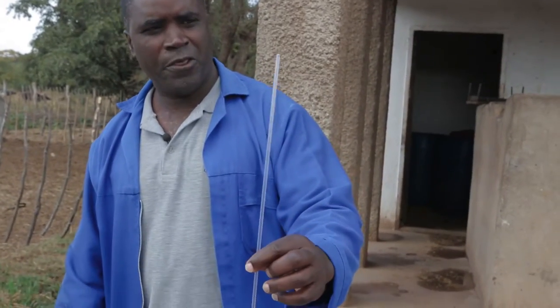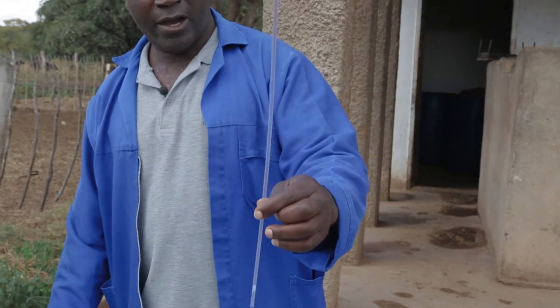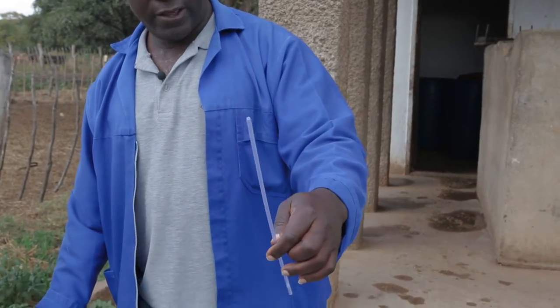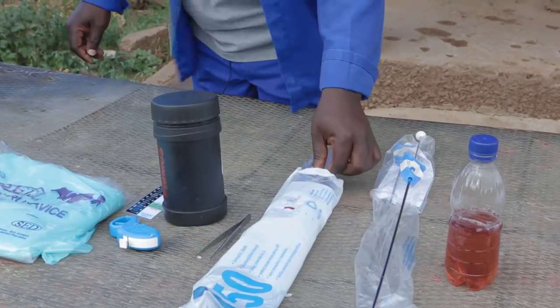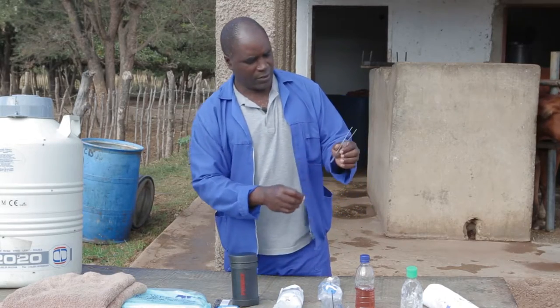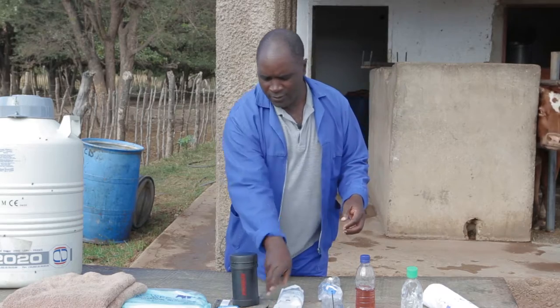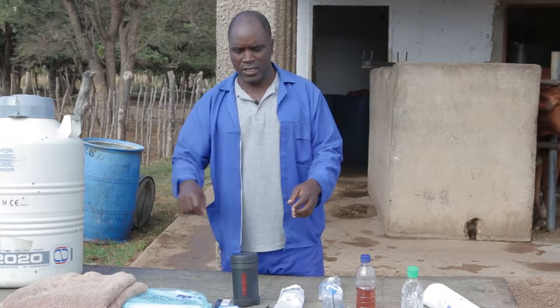This is the AI sheath. It is used to cover the AI gun so it can hold the straw together in the AI gun. And this is a pair of tweezers. It is used for picking semen from the goblet.